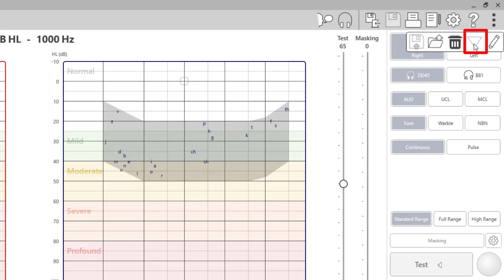The triangle icon will give you access to the system calibration information. You can view existing calibrations, load calibrations for a new system, or load calibration files from your annual calibration.